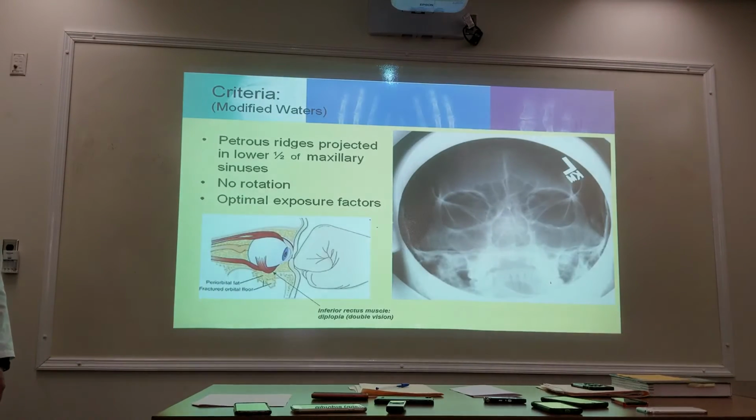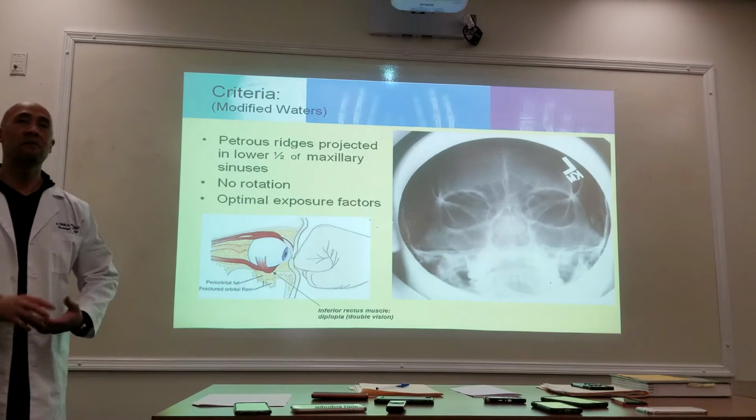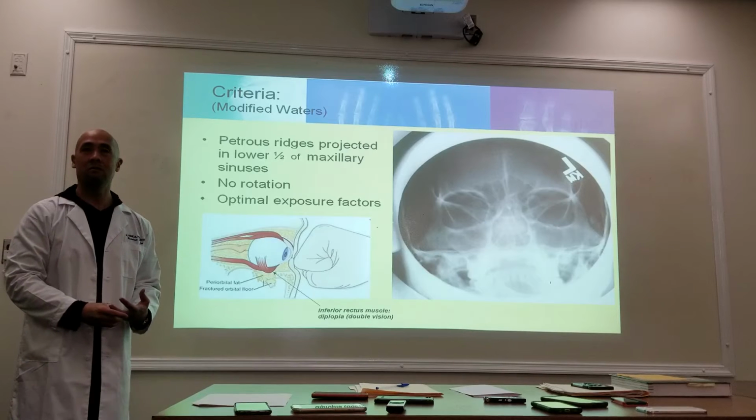Yes. So in these different studies, depending what you're focusing on, do you use a collimator like a cylinder to get a better shot, or does it really matter? It doesn't matter, because let me ask you this: how many of your places still have a cylinder cone?